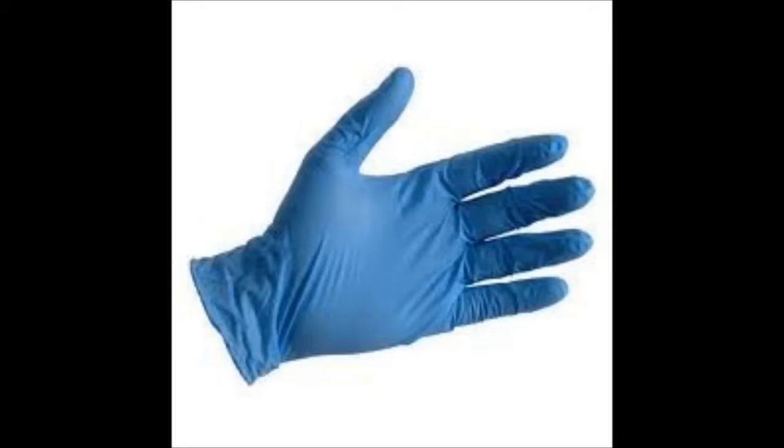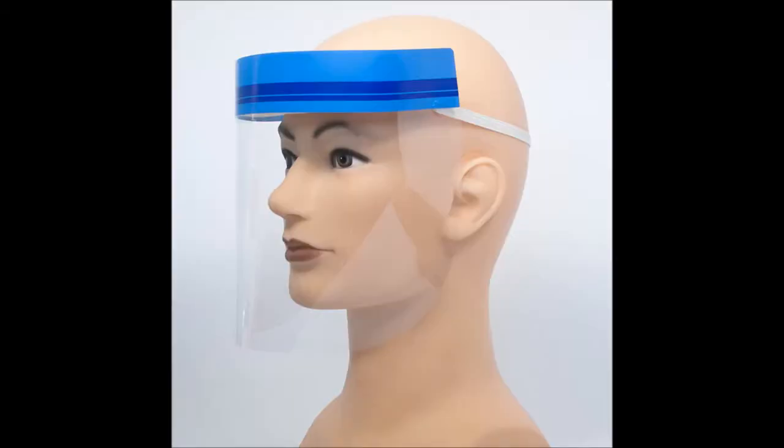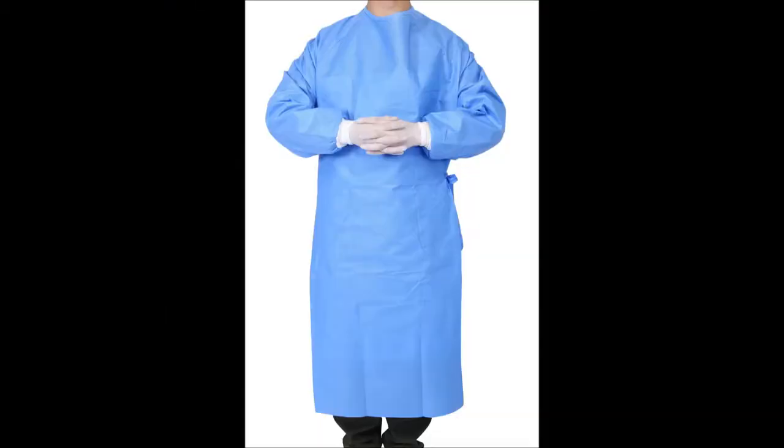Please ensure the correct PPE is worn throughout the reprocessing stage, which includes disposable gloves, a face visor or mask, and a disposable gown.